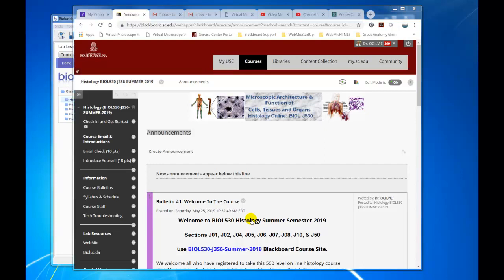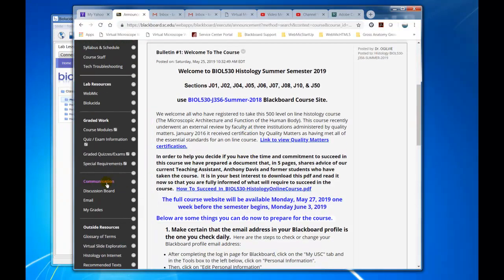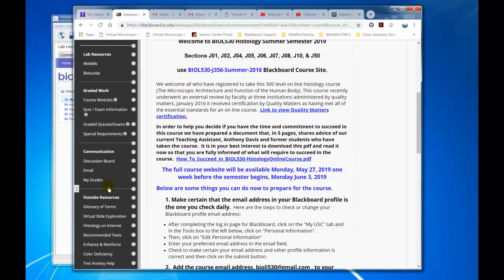This is the third video orienting you to lab study in the histology course. This third video will focus on the use of Biolucida lab specimens. And remember that if you haven't done it yet, you should do it very quickly.